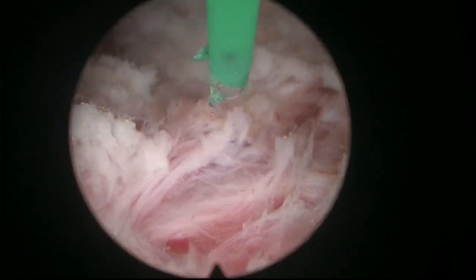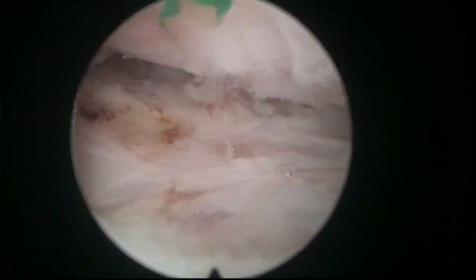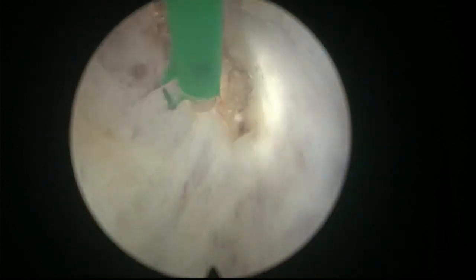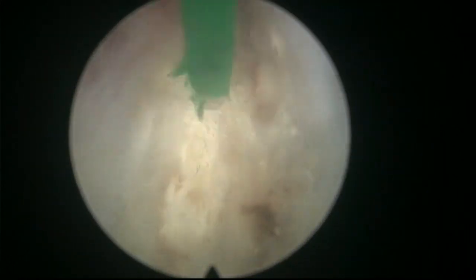So that's the posterior plane. We have a much better plane than we had, let's say here, where the plane started changing direction. You see that's a little bit flimsy there, but we managed to correct the situation. All right, so now I'm going to focus on the anterior. I think we have done quite a lot of the posterior dissection.